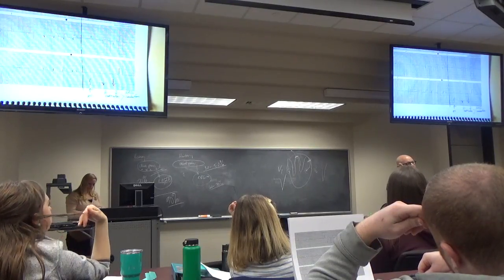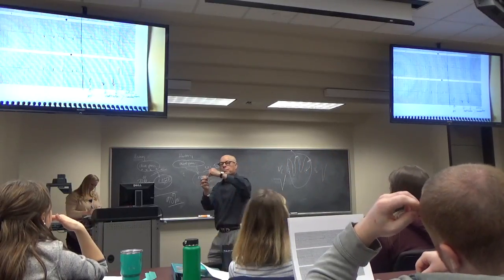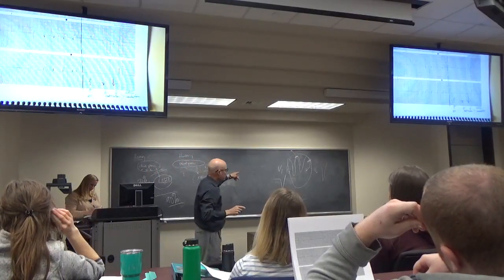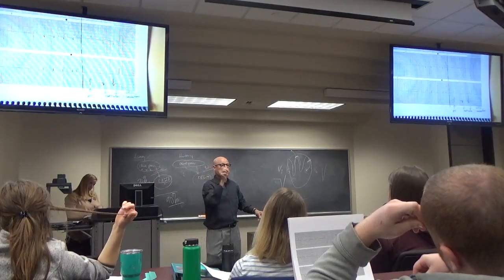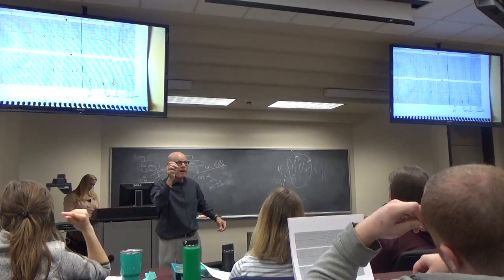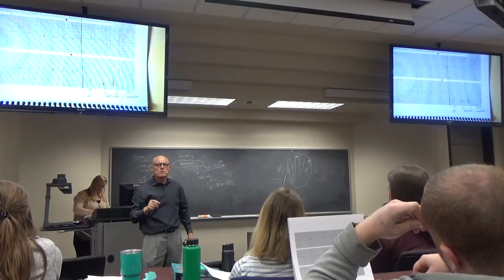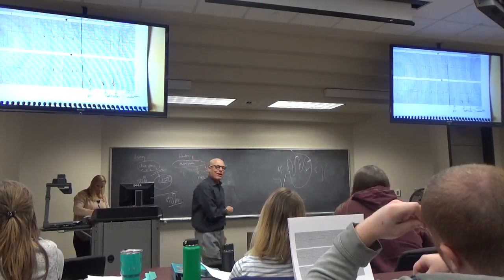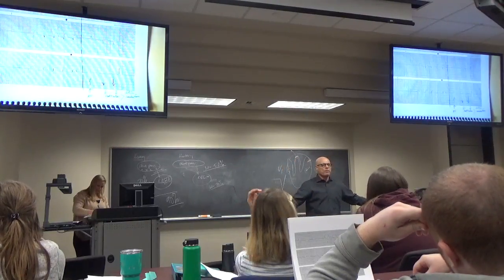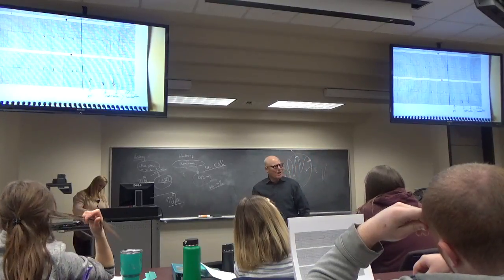Well, it not only has this little thing that can burn a hole, but it also has two electrodes on it, so we can map where that pathway is. We just stick it here and there and get a map, and we find the pathway. Once we find the pathway, we burn it too. We just burn it with this electrode. Then we pull the catheter out. They're no worse for wear, and that hole will heal. That hole we put in the septum.